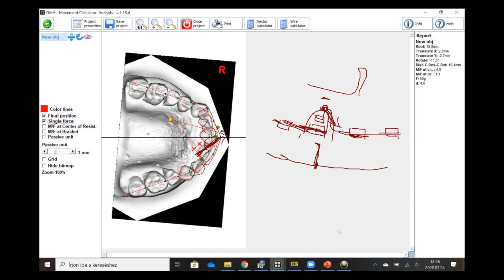And this means that you will have a cantilever coming from this side. If you look at the connection between this point and this point, more or less, you see that the force is not very far from a perpendicular to the structural axis of the cantilever. So this came very natural. A cantilever which is engaged in a tube here on the right, and then attached here to the incisor, will do most of the job. And then you will probably finish with a large space in this area.